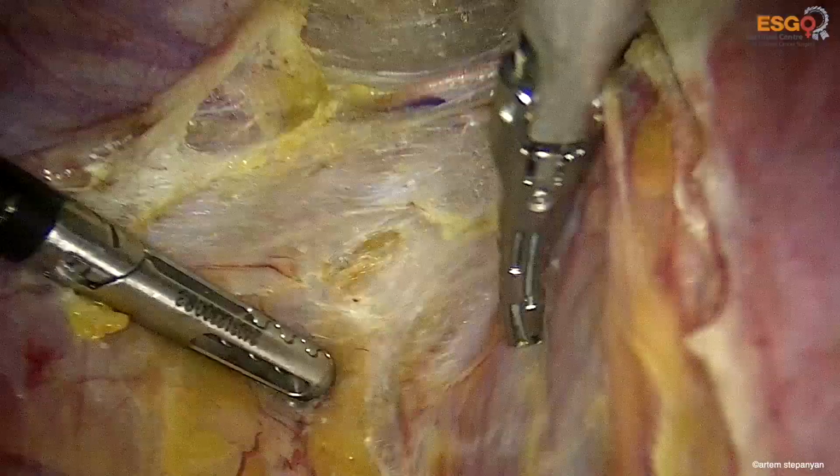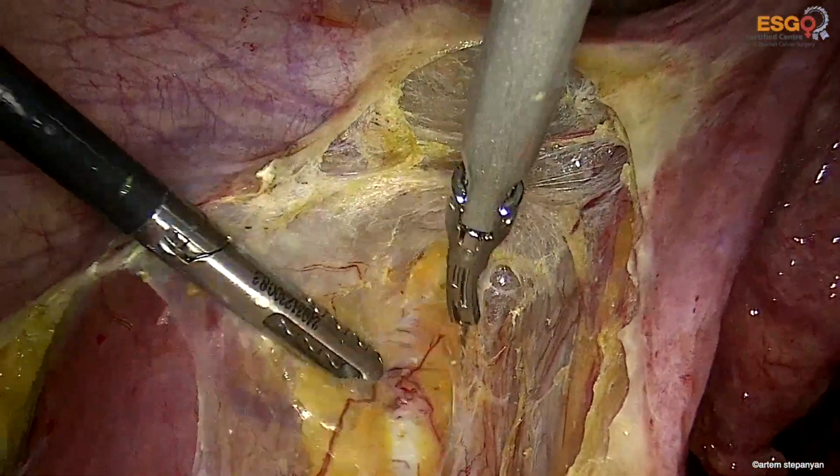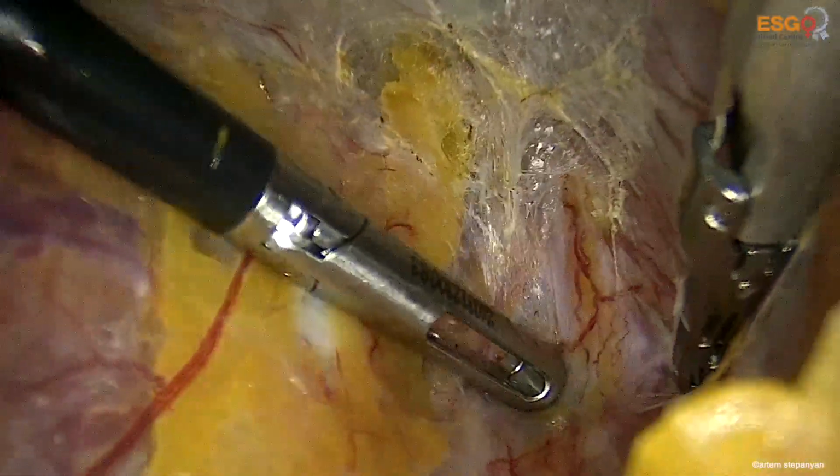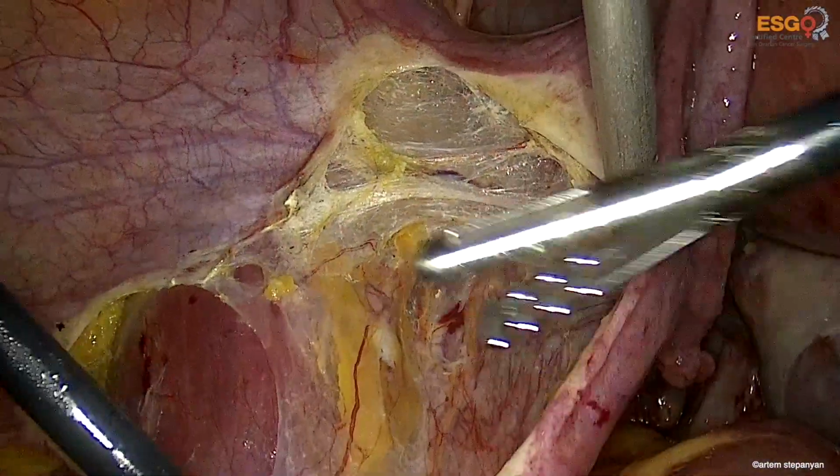Once the ureter is found, we proceed with the dissection caudad towards the uterine artery.